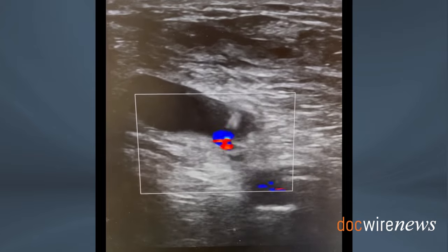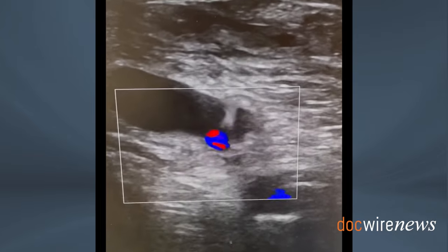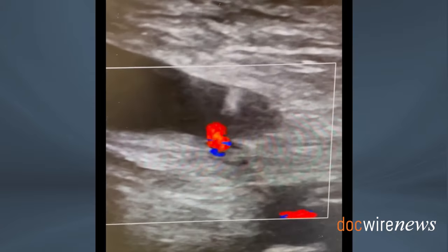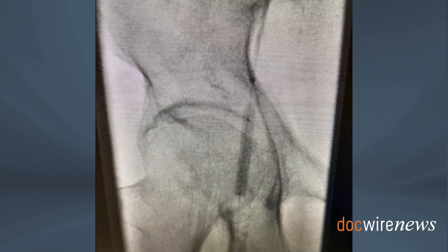It's also important to image the actual superficial femoral artery or common femoral artery — wherever the pseudoaneurysm is originating from — to always have it in sight, especially with the neck.